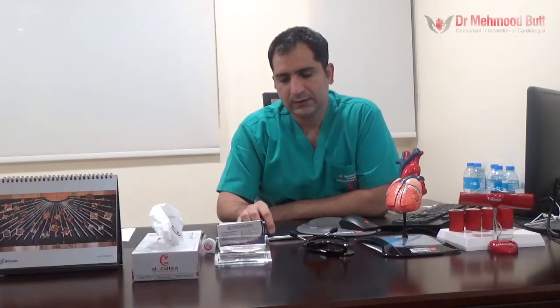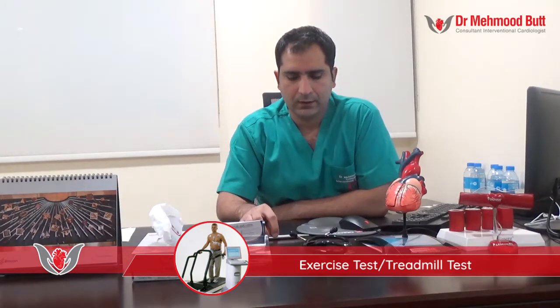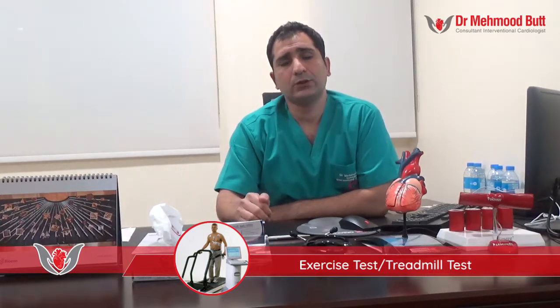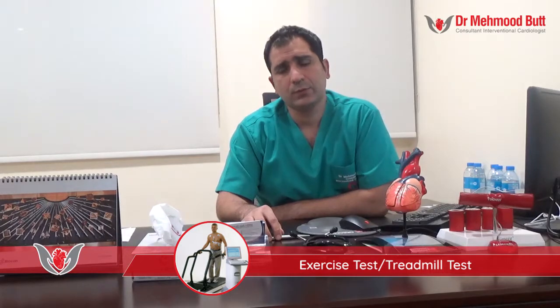The exercise tolerance test, or stress test, is usually done on a treadmill machine. This is a non-invasive test to exclude angina or a past heart attack. You will be expected to walk on a treadmill whilst attached to an ECG and a blood pressure cuff. After about nine minutes, we get the results through continuous monitoring of the ECG and blood pressure.